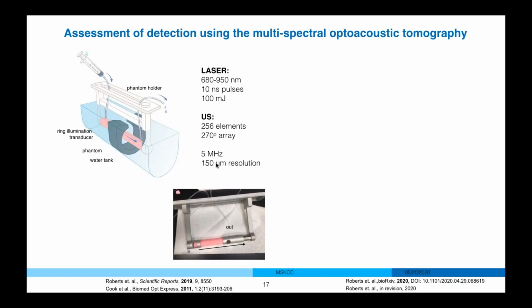So talking about phantoms, we have created soft tissue mimicking phantoms for our MSOT, and we tested different concentrations of our dye. These are phantoms based on work by Cook in this reference here.